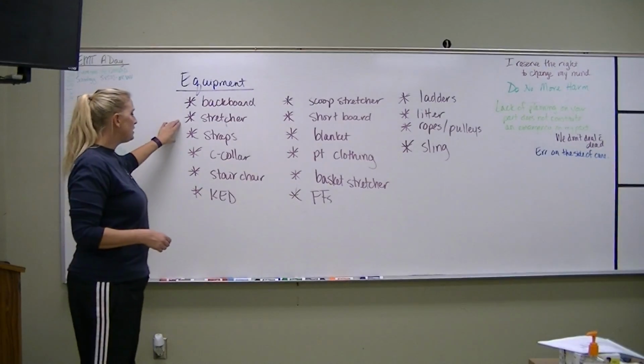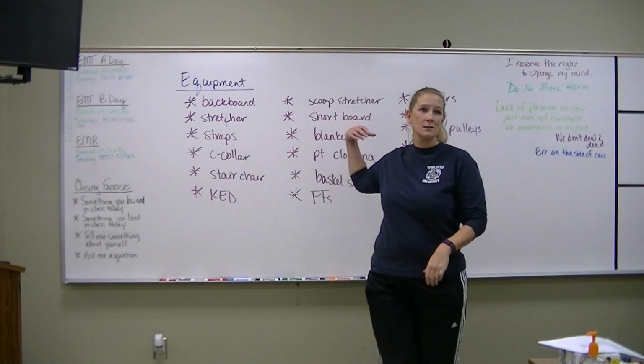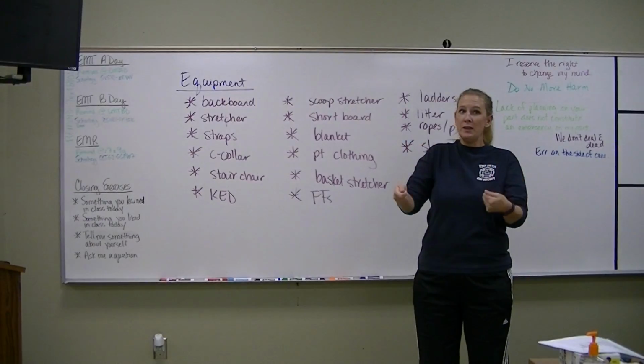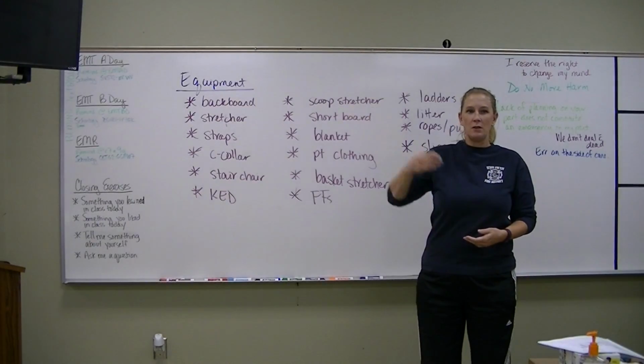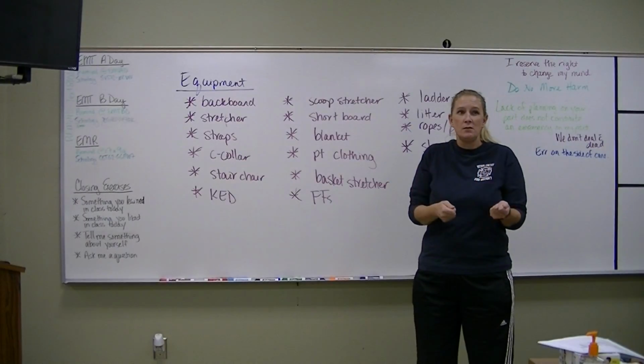The stretcher is used in combination with almost all of the rest of these. Your stretcher is used to get your patient from wherever you can get them on the stretcher to the ambulance. All of the rest of these are used to get your patient to the stretcher.